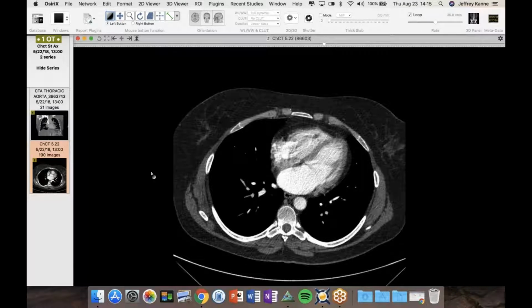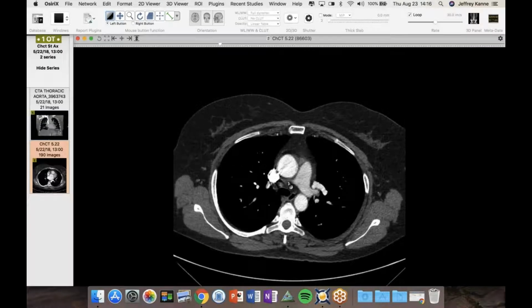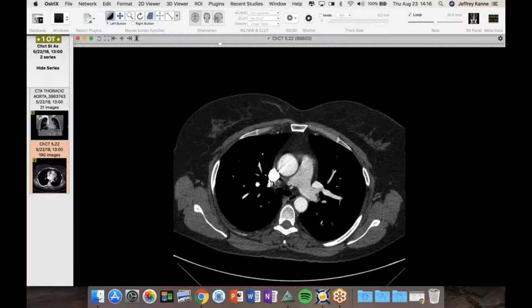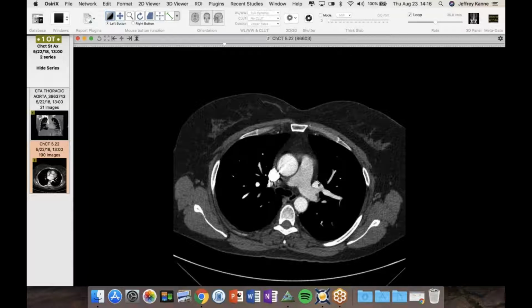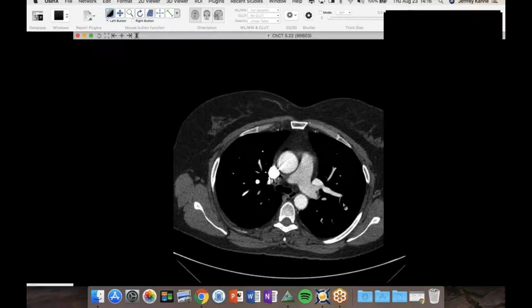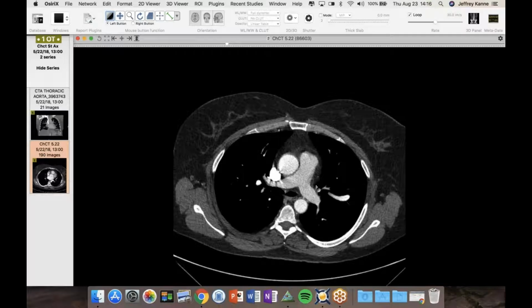When I see these, there's no left superior pulmonary venous ostia, so it goes into the hilum where it should then drain into the left atrium, and then it doesn't exist. I think there's some sort of either intrauterine or some sort of something that happens to that ostium, and then it finds another way to drain and basically goes back out in the lung. Do you think it actually does enter the mediastinum and then just turns around and goes back? Yeah, I think so. I think it's going to where it should be going to an ostium, and then something happened with that development, and it has to find another way out.